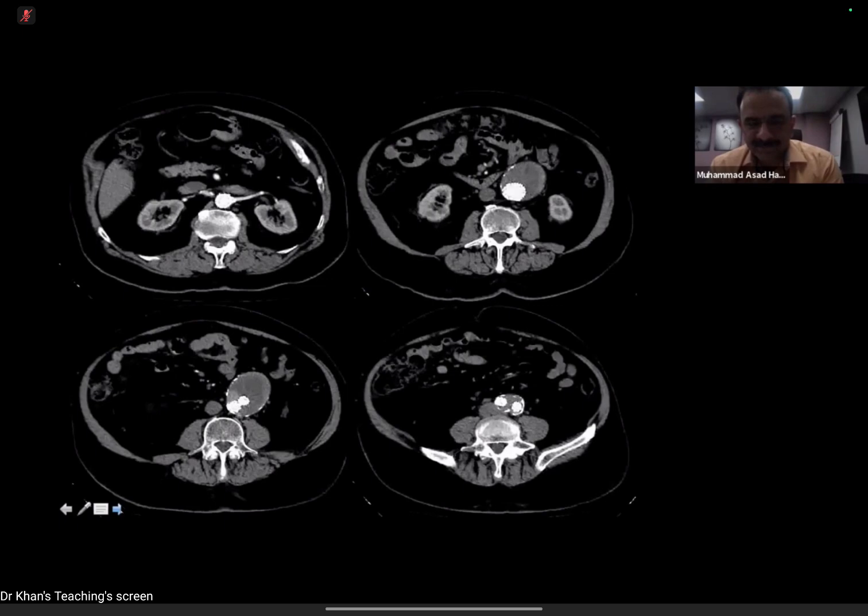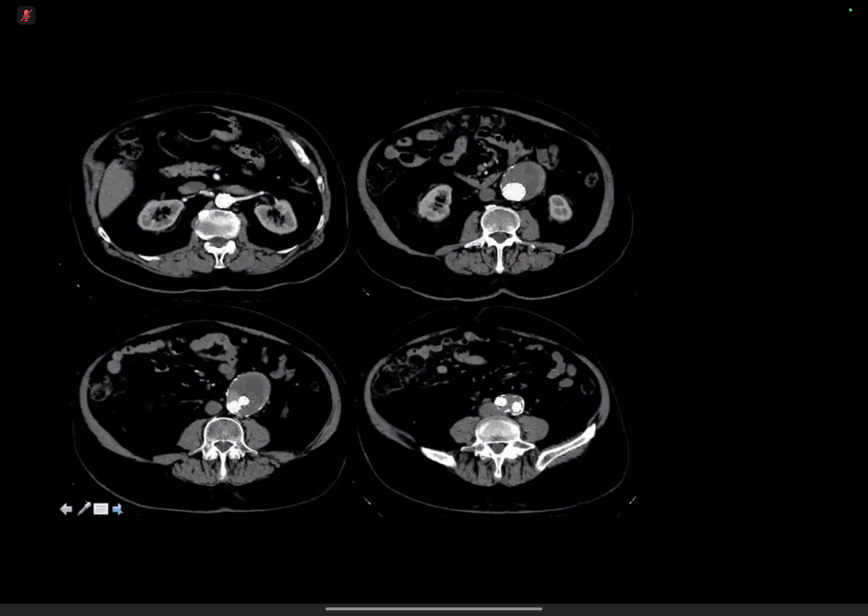On a similar theme, please describe your findings in these CT images. These are selected images in the arterial phase of the lower abdomen. There is an abdominal aneurysm, once again, which extends into the iliac arteries bilaterally. It doesn't appear to extend suprarenally. Both kidneys demonstrate normal enhancement bilaterally.